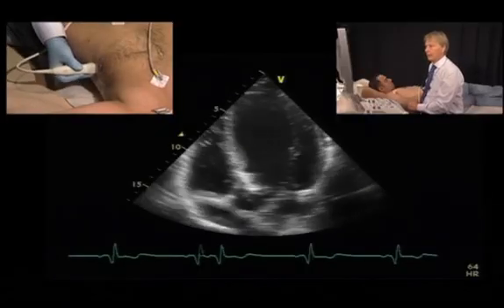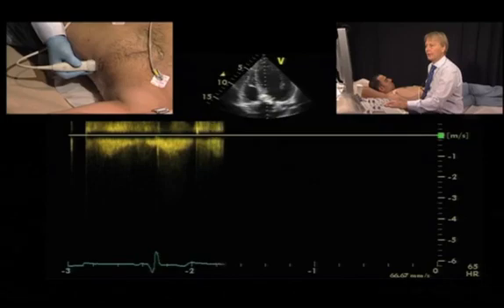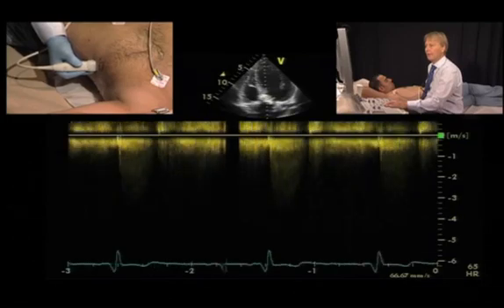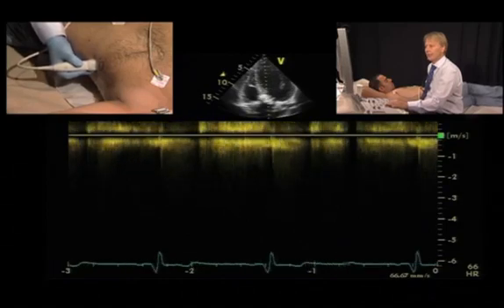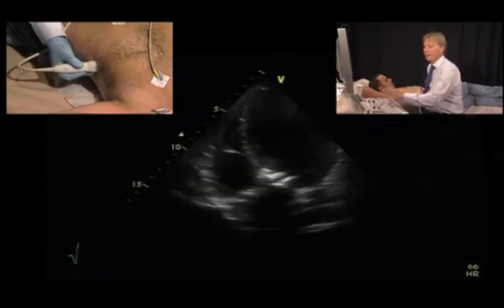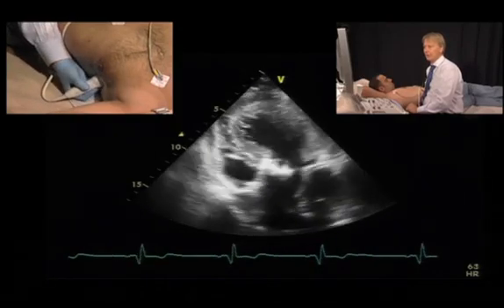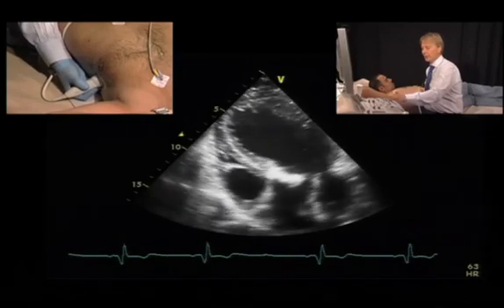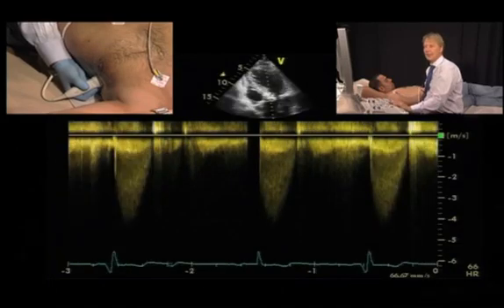To quantify aortic stenosis with CW Doppler, start from the apical approach. Try to get an apical five-chamber view and place the continuous wave Doppler cursor right inside the valve. It's very important to put the focus point exactly where the valve is. If the spectrum is not very good, you can optimize the signal by moving your transducer further lateral, getting a much better angle to the ultrasound beam and being truly parallel — this way you will usually get much higher gradients than with the classical five-chamber view.